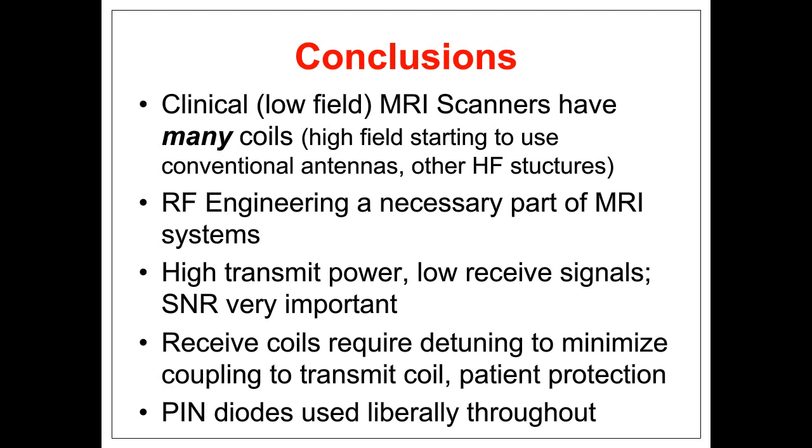PIN diodes, which is something I've been studying over many years, are used throughout. They're used for TR switching. They're used, on the receive side, for patient protection, detuning, decoupling, a host of activities.